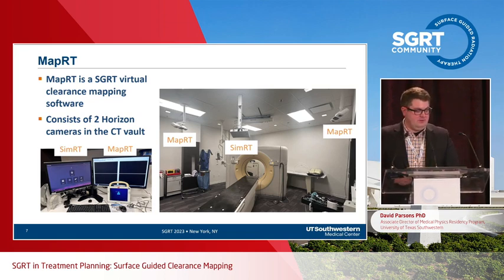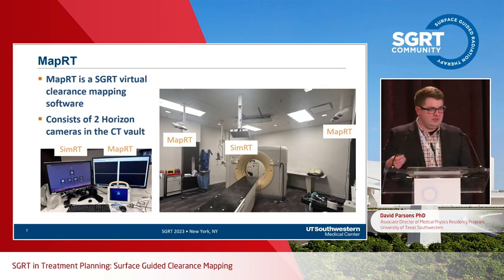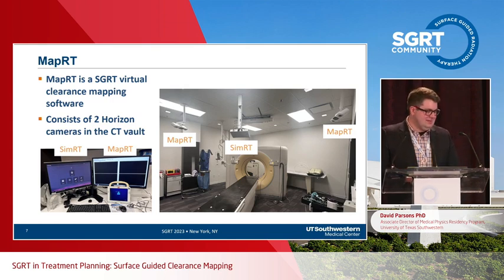We found that the vault area is actually the best place for it, because that's where you're actually moving the patient and positioning to take your capture. The 2 monitors are side by side for the 2 systems in our vault, and we have 1 keyboard and mouse that you can toggle between to control both systems. It's set up on a rather small counter in our vault due to limited space, like I assume most people have.